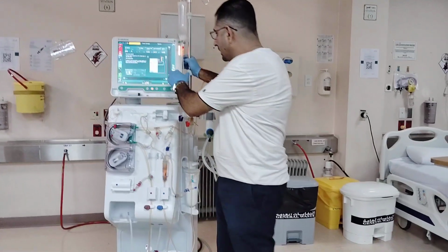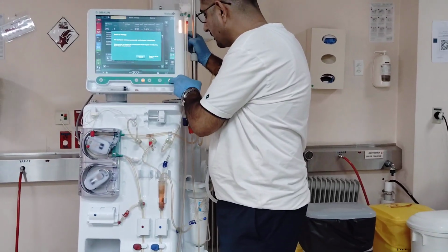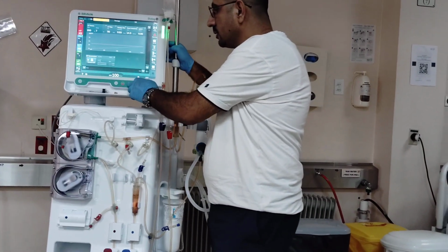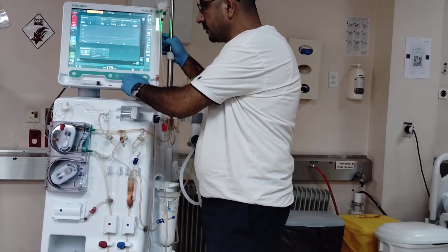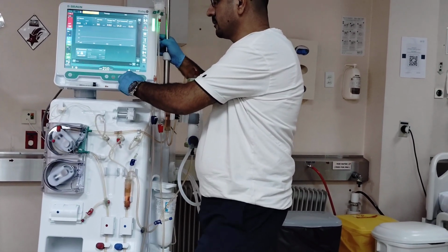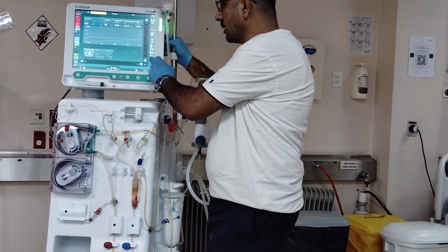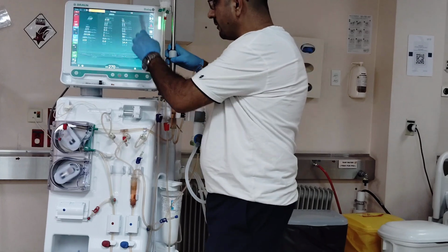Okay? And again, to go back to the therapy, I press here after connecting the patient and press control to go back. By pressing on the protocol, it will be the same as info setting.